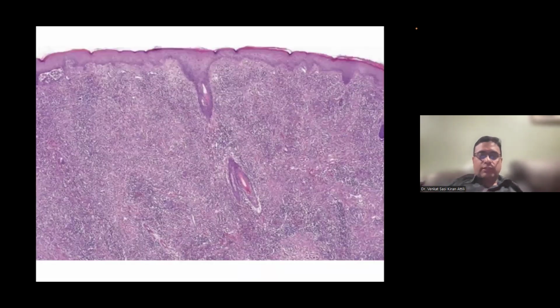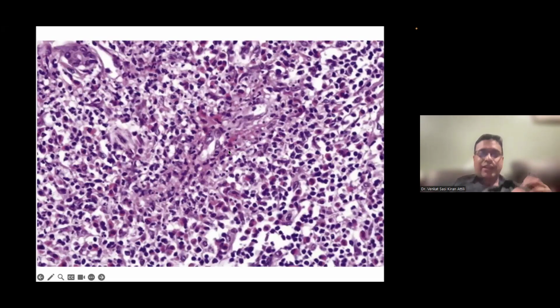Now, these are difficult cases histologically. Often what we see is a dense mixed infiltrate of lymphocytes, plasma cells, neutrophils, and sometimes eosinophils as well. There's often a Grenz zone of papillary dermal sparing, with a dense infiltrate in the dermis. Then if you look hard enough, you see nuclear dust, and nuclear dust is a clue to the presence of vasculitis here. You may or may not see a fibrinoid vessel wall change, but you often see hemosiderin, which is an indication of there being extravasation of RBCs. You're seeing lots of plasma cells, lymphocytes, and sometimes histiocytes may also be present. So it's a mixed infiltrate.